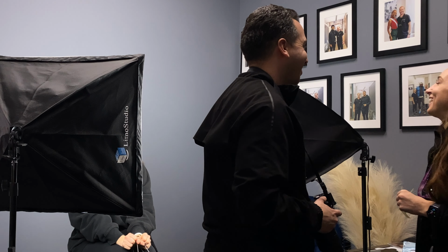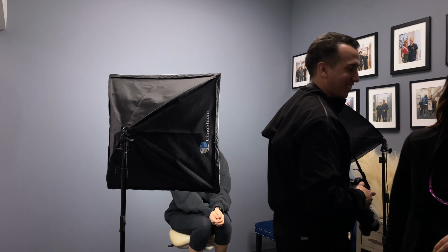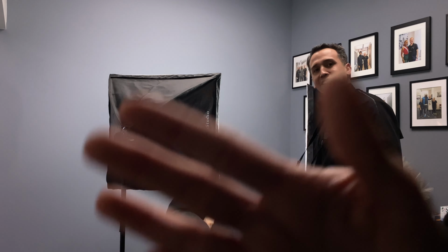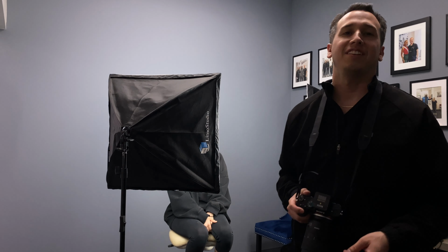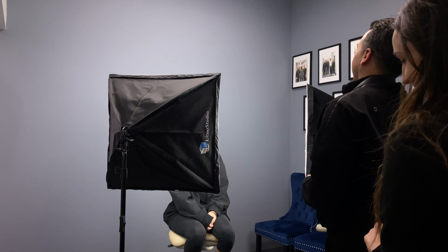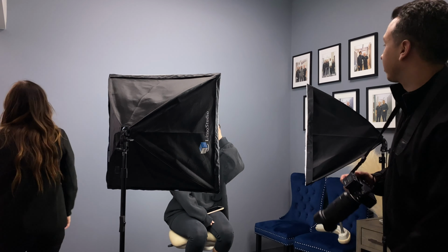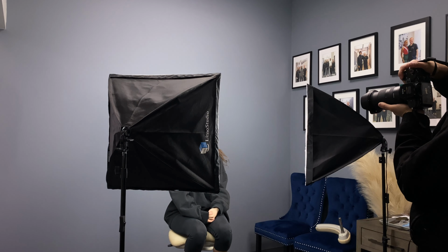This is Kylie. She kind of helps me sometimes take these photos. This is actually a friend that's got the Smile giveaway. So I think I take a total of 8 shots. I do the extraorals first, and then do the intraorals, and then I do the contrast shot. And the last shot that I do is that portrait shot.